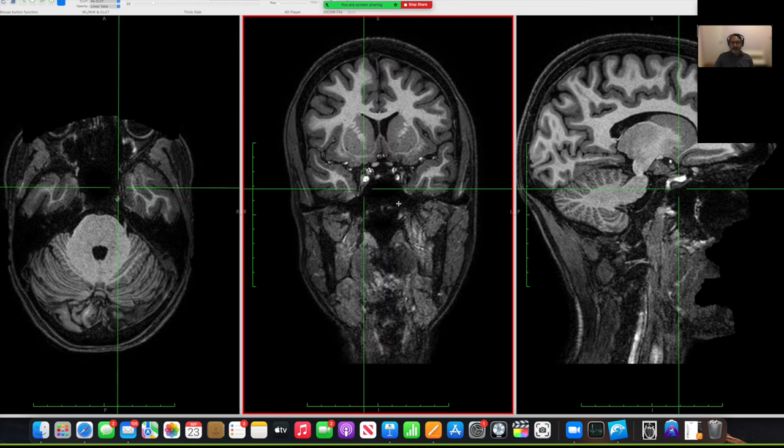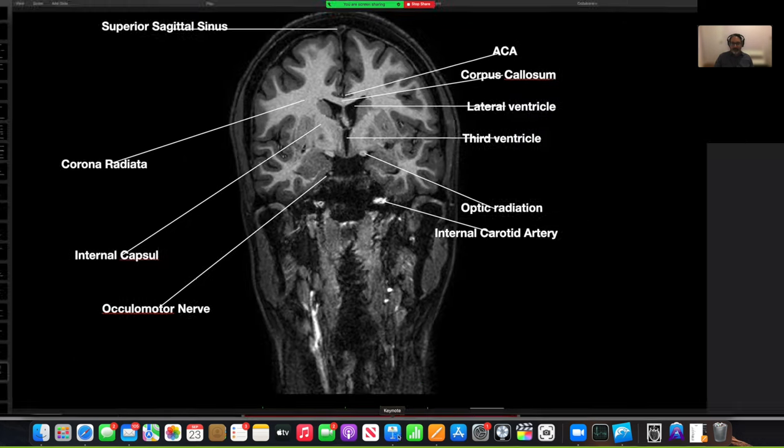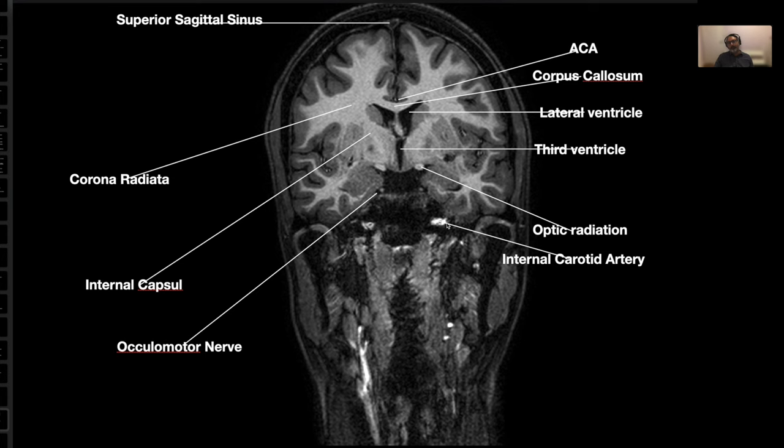And so it's just the path of the internal carotid artery. And I think in the quiz, that's one of the questions, the horizontal aspect where it is the internal carotid artery in the carotid canal. There you go.